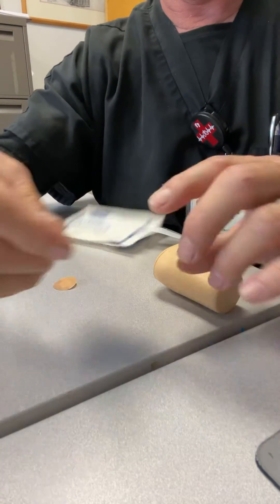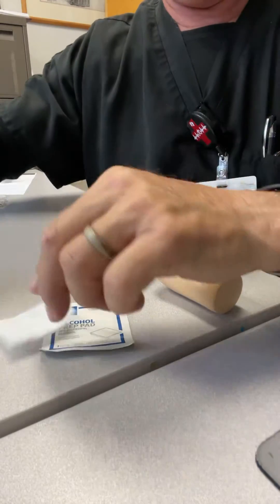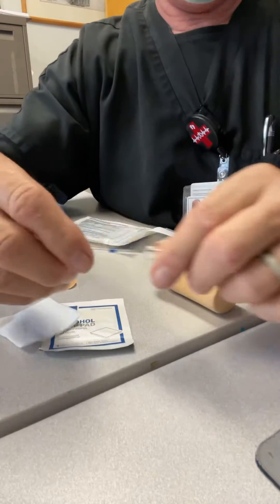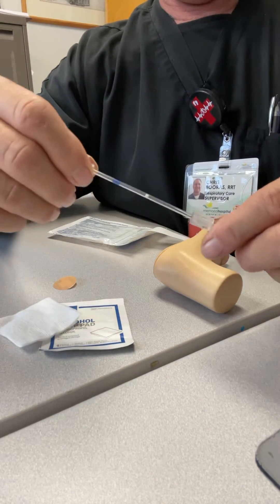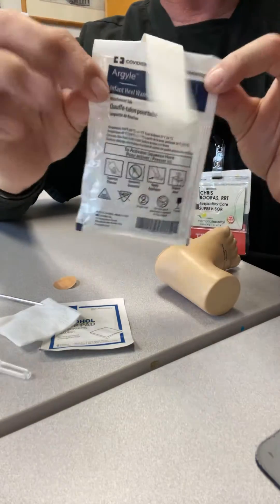The first thing you want to have is an alcohol swab, a 2x2, a lancet, a capillary tube, and a heel warmer.